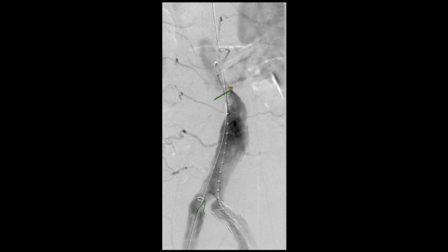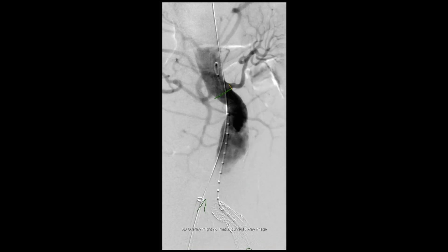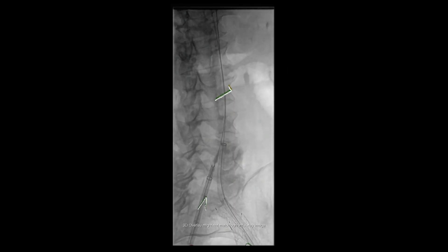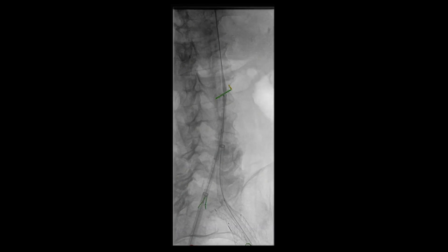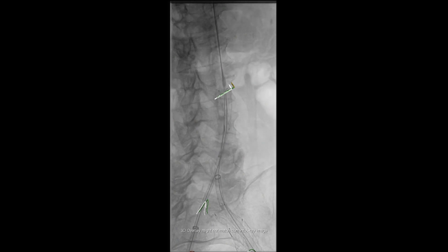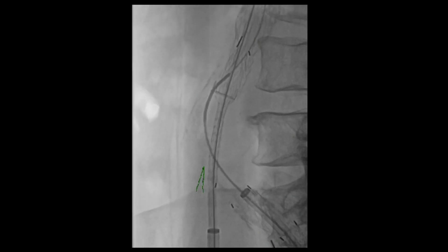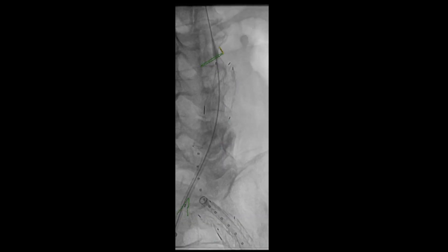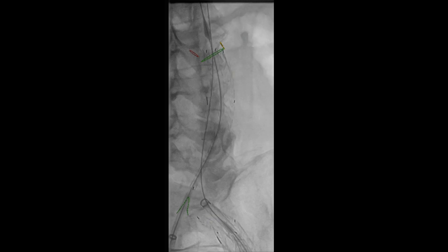Another abdominal aortogram is then performed to proceed with completion of our infrarenal endograft placement. Through the right common femoral artery access site, a main body is introduced into the infrarenal aorta and positioned just below the renal artery. We then proceed with deployment of the main body. Once deployed, we proceed with cannulation of the contralateral gate using a curved catheter and soft-angle glide wire. A pigtail is introduced and rotated 180 degrees to ensure adequate cannulation.